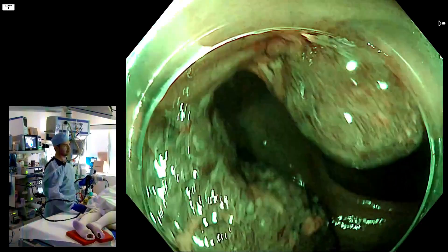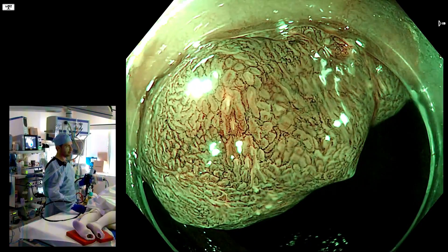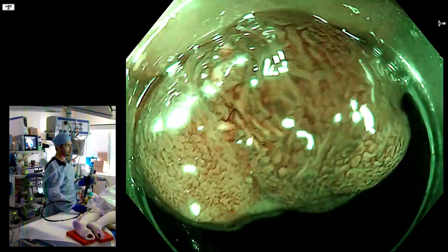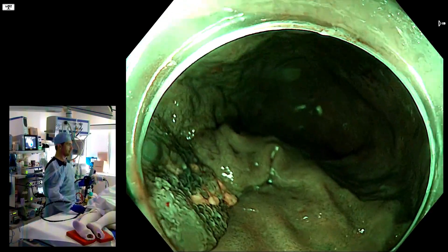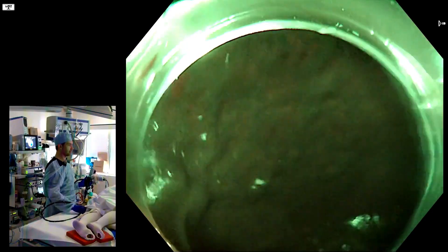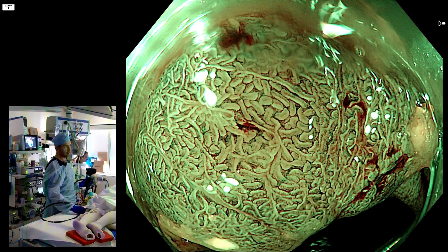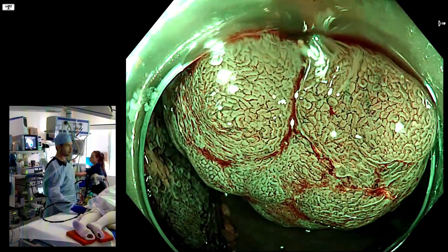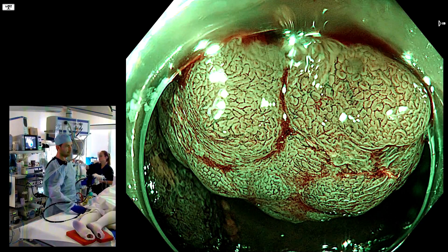And then you have this lesion, which looks very different to the others. You can already see it coming into the cap — remember to freeze to get your brain in. That looks relatively regular, but there's some irregularity creeping in. Is that whole thing like that? You can see the use of the cap here. Maybe we're too distended as well — distension is a very important part of imaging polyps. Let's take the distension out a bit. Here it is. You can see now I can get much more view on it with less distension. The pattern is starting to break down, but it's certainly not completely broken down. This would be something I would call regularly irregular, and this one is much more heterogeneous — over the surface there are different areas present. The pattern is becoming irregular, but not completely irregular. So this is J-Net 2B.